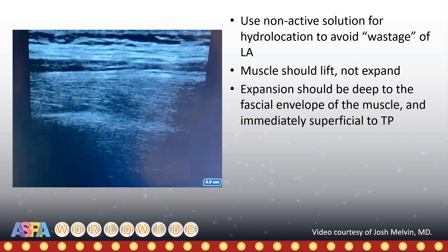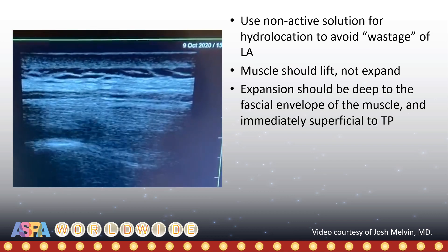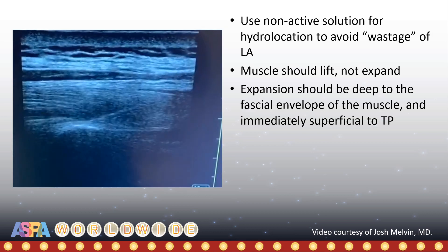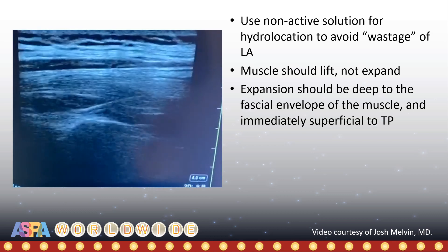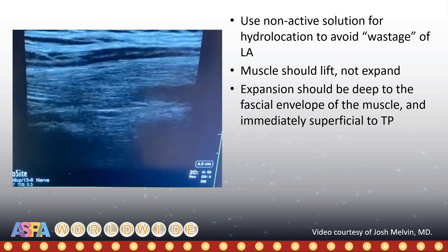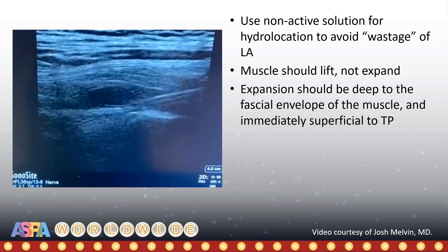A final recap of the main points. Always begin with saline or dextrose as the injectate to confirm entry into the correct plane. The muscle should lift but not expand. But as illustrated here, it is still possible to be on the wrong side of the thoracolumbar fascia. While injecting, therefore, it is advisable to scan dynamically and observe carefully to ensure that fluid is spreading under the hyperechoic fascial envelope of the muscle and not above and within it, as in this case.